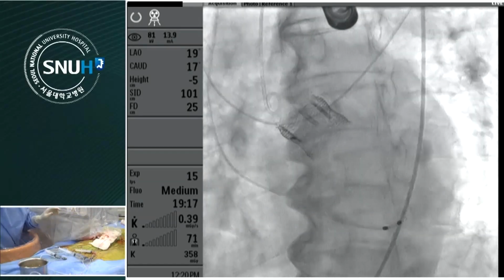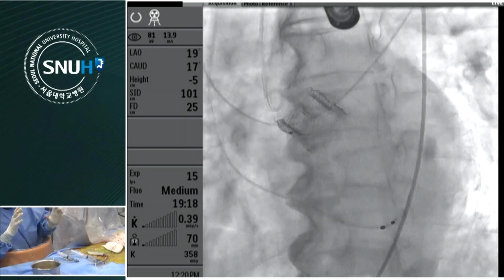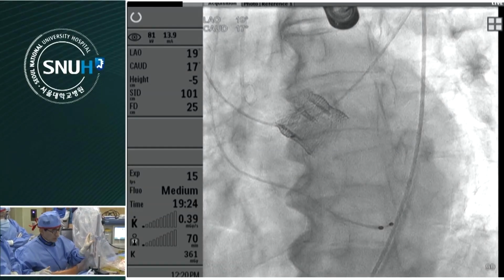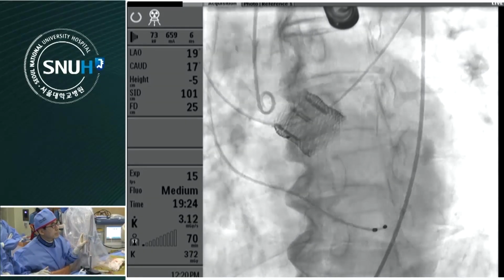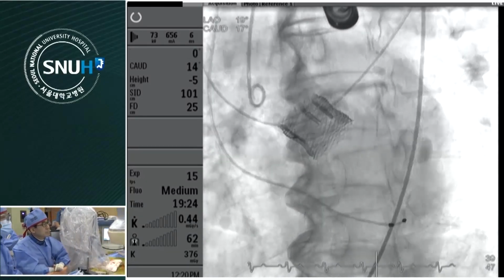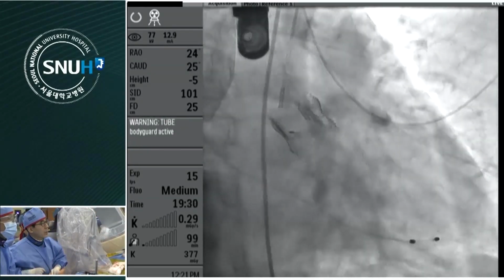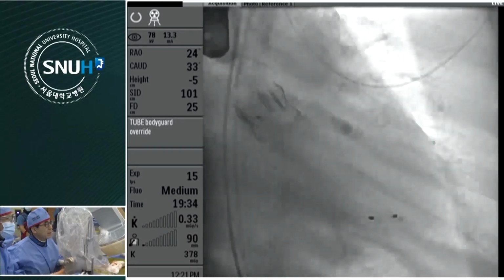Ready? It is very important to make the valve tangential with adjustment to projection angle. That is very important. Cine. Shoot. Okay. The other angle. Very good result. No PPR at all. Caudal. Maybe trace. No trace. More caudal to make the three posts in a single plane. Okay.